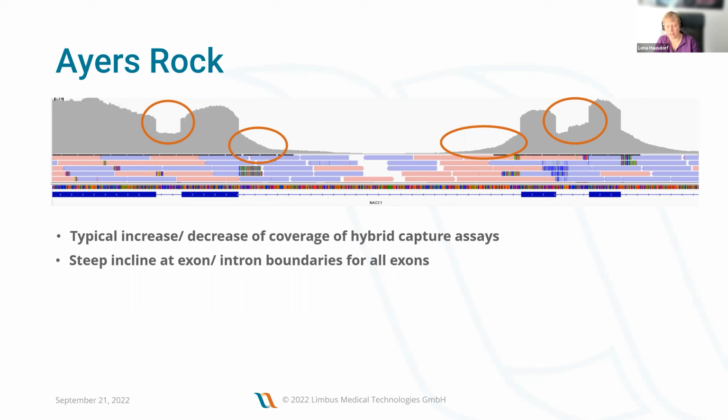But the cases themselves you can look at as long as you have Varvis. And one frequent question: you can always re-annotate a case without additional cost. Even after 3 years, 4 years, 5 years, we don't care. It's your data. Only the processing initiates pricing.